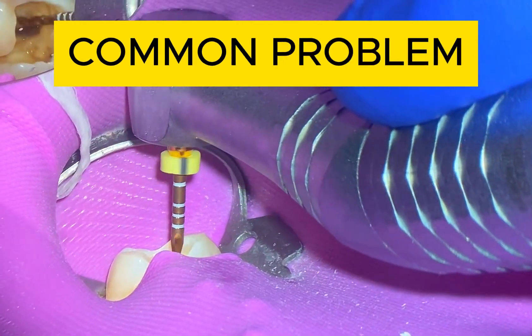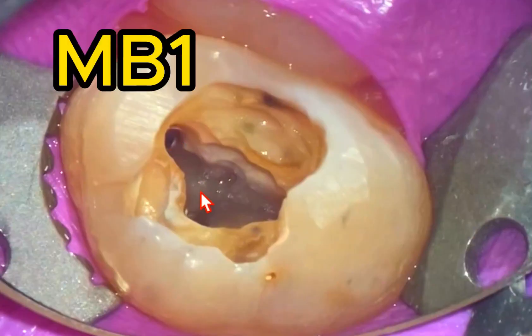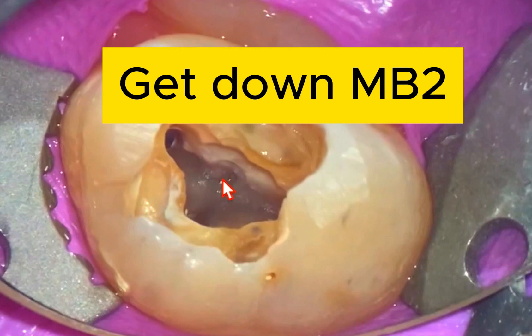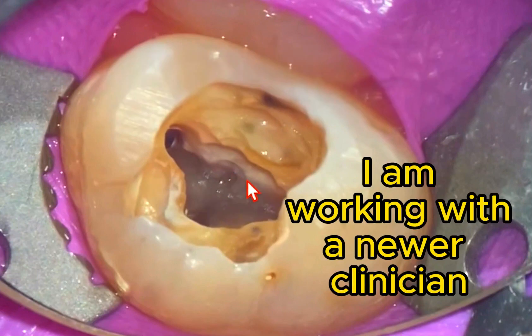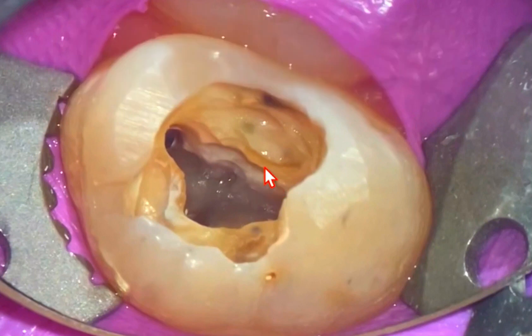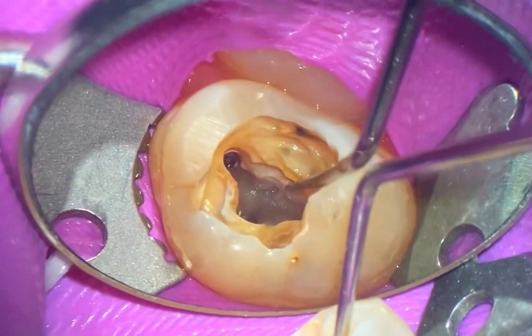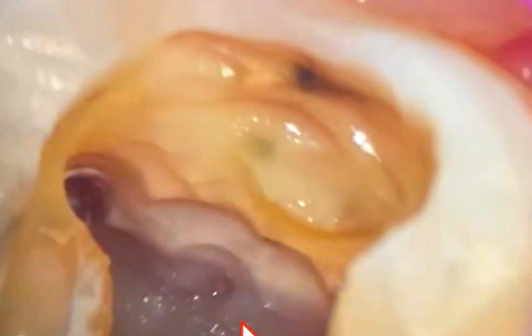Here's a very common problem that I've seen over the years — trying to tackle MB2. Here's MB1, distal buccal, palatal canal is right here. Everything's clean and shaped, and all we need to do is just tackle that MB2. But the problem the clinician was talking about was that the file bends when they put it in, and they're trying their hardest to get that file in there and starting to get frustrated.